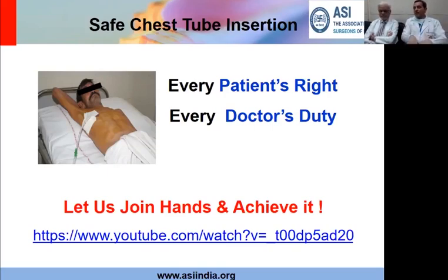Now, if it's going inside, then it would be coming out through your chest tube, and you will have more than 150 to 200 cc per hour of blood coming in the chest tube. Then that becomes an indication for exploration.